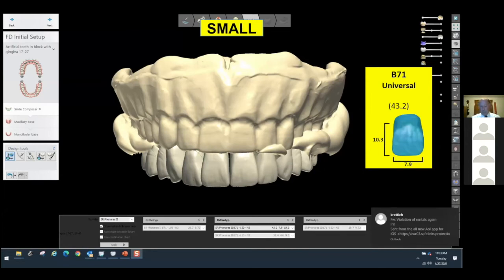So we took impressions and a bite, and this is scanned. What I did is I selected some teeth and put them in this relationship, because this helps my vision of looking at the patient's existing teeth, and depending on my comments or the patient's comments about their existing teeth, they may want it to look like this or not.